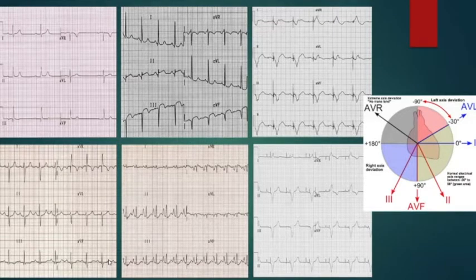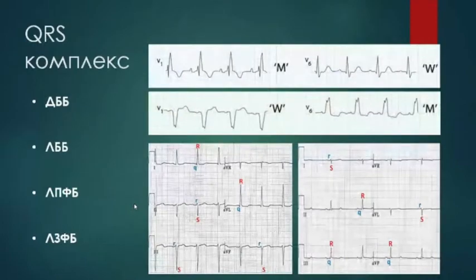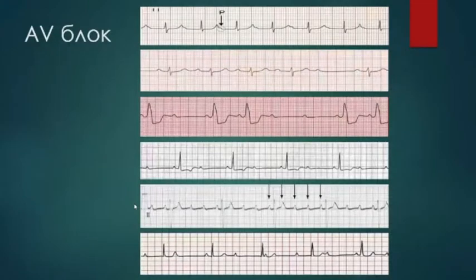So, what's next after P wave determination? You are defining every component of the PQRSTU. So what's next? You have intervals, you have segments, you have... Is it the PR interval? PR interval and QRS complex. Yes. Etc. Whether I have something about it. No. Not usually.